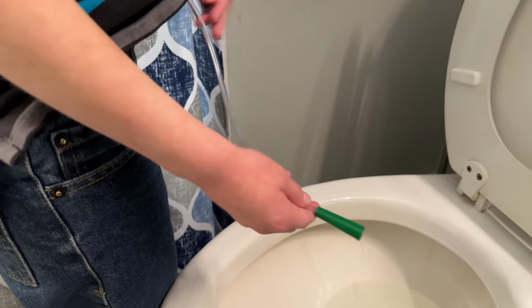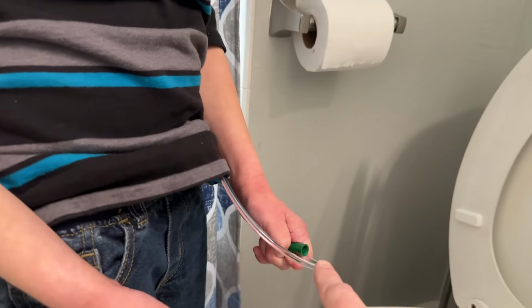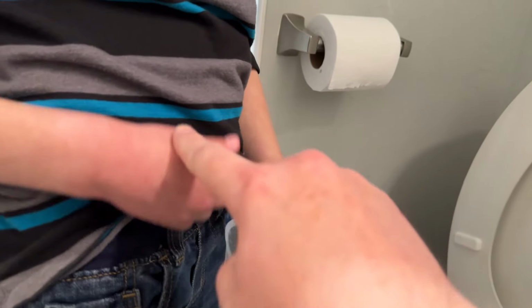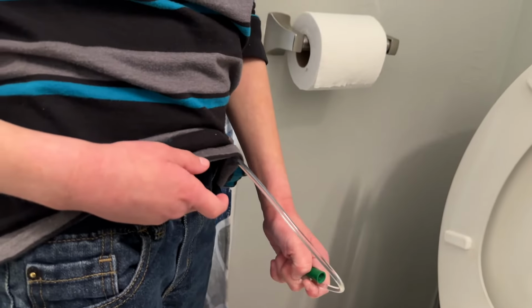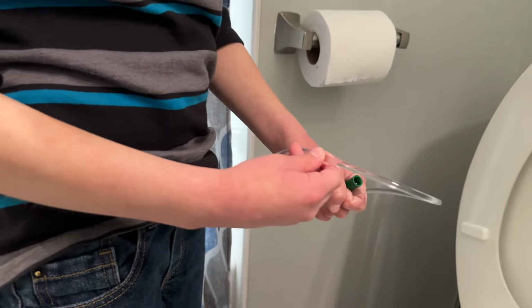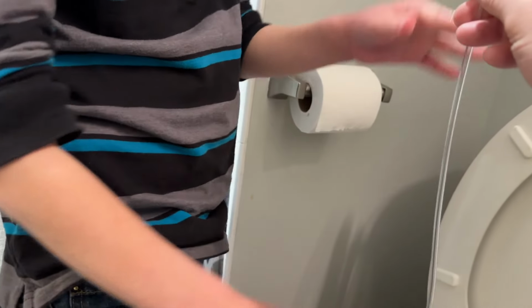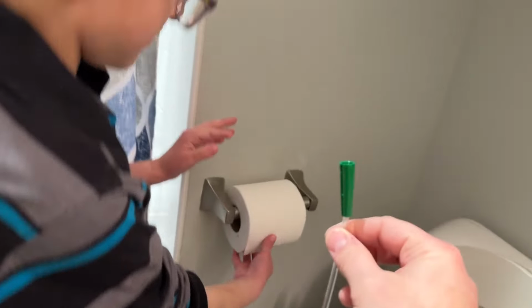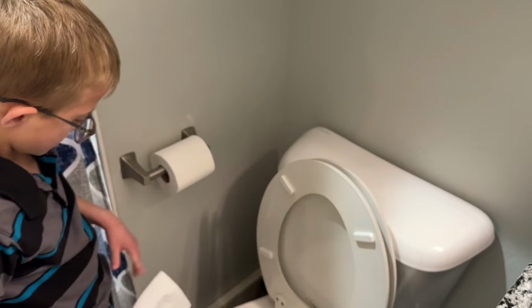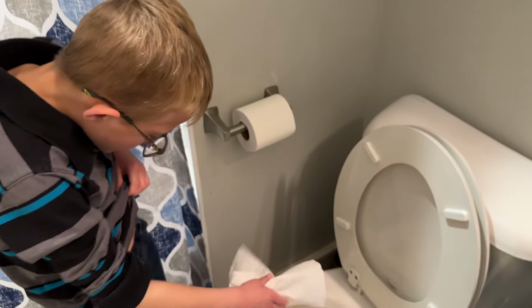So now that we're done cathing, we see he's done peeing. First thing we do is kink the end of it, kind of like you would kink a straw, because you don't want the fluid that's in here going back when you pull it out. If you didn't kink it, all the fluid that's in here would go back into his stoma, into the one-way valve, and cause irritation or things like that. So we kink it first, then we pull it out and drain it in there. You can give that to me. And then make sure you wipe your jelly, because sometimes that jelly leaves itself on there. So just a quick wipe and toss it in.